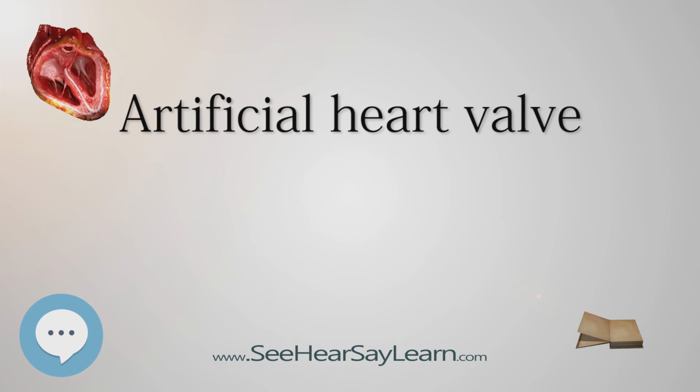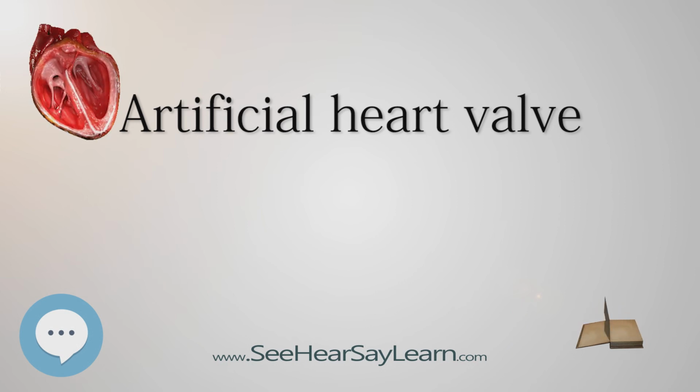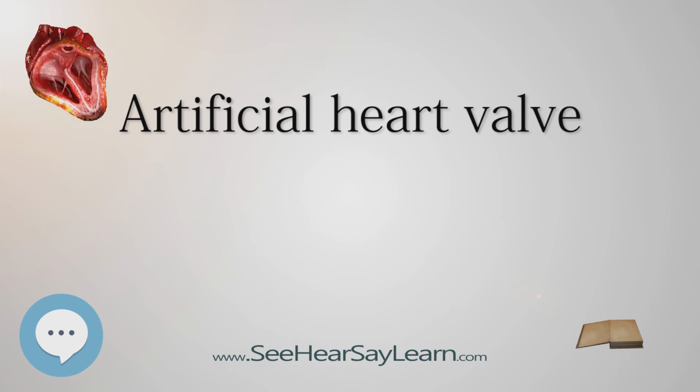Mechanical valves. Mechanical heart valves, MHV, are prosthetics designed to replicate the function of the natural valves of the human heart. The human heart contains 4 valves: tricuspid valve, pulmonic valve, mitral valve, and aortic valve. Their main purpose is to maintain unimpeded forward flow through the heart and from the heart into the major blood vessels connected to the heart, the pulmonary artery and the aorta.